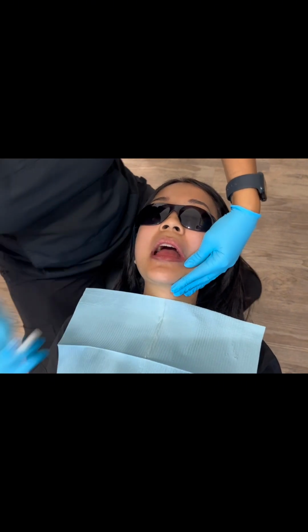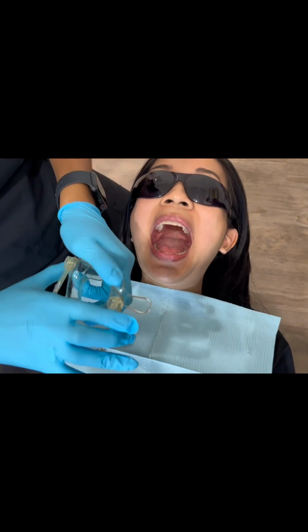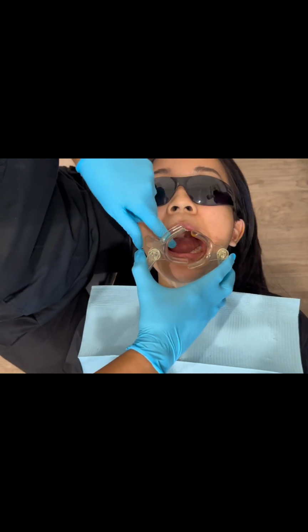I love our team. And so I put the Vaseline to make it comfortable for the patient because these cheek retractors are stretchy. I always have the patient relax. So relax, patient.